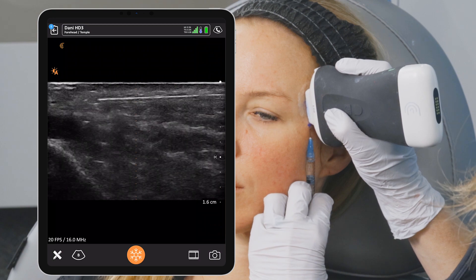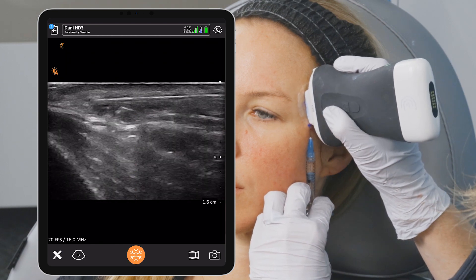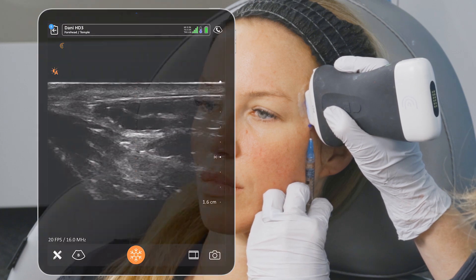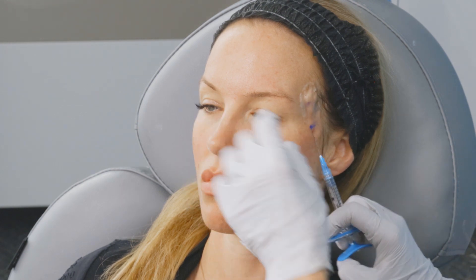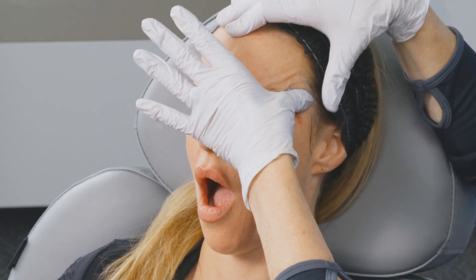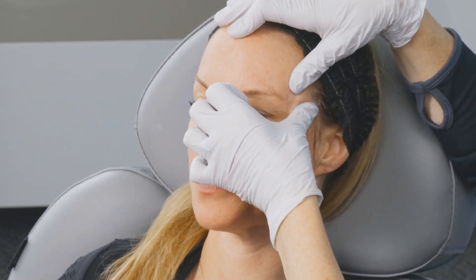Now we can watch as I put in a little bit of gel filler — we can watch it go in. We're just going to lay that bolus; you can see that tissue spreading. Now that we know we're in the right plane, I'm just going to lay that bolus down. You don't need to worry about it turning into a little mashed potato clump, because you're just going to massage it. A lot of times I'll have them open and close their jaw a couple of times to help massage it out — usually massage kind of up and back to make sure it spreads nicely.